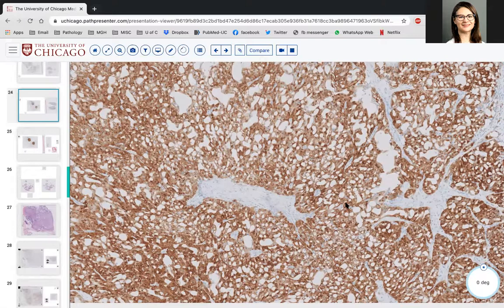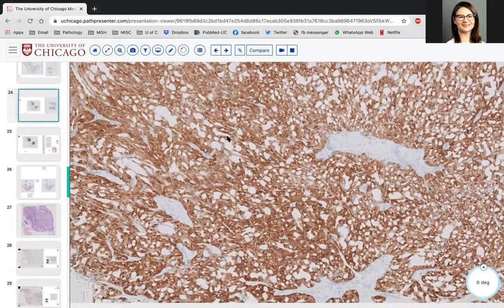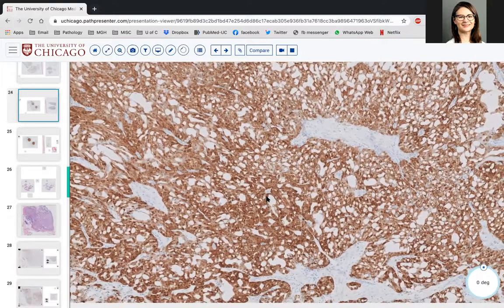And thankfully, this also kicks off what other one? Acinic cell carcinoma. Exactly. So this does kick off the microcystic variant of acinic cell. Reham mentioned PAS diastase, which could also help if you don't see zymogen granules, but S100 would serve this same function.